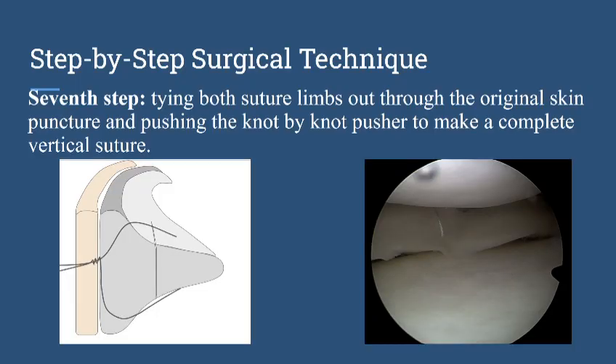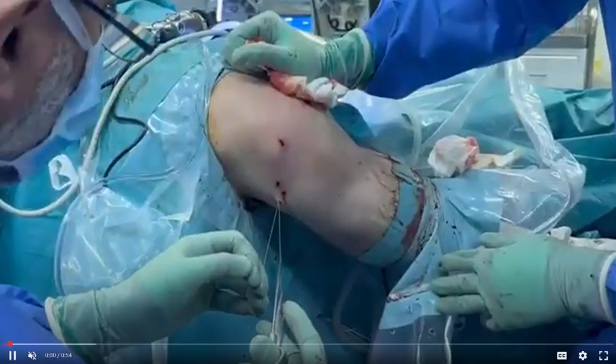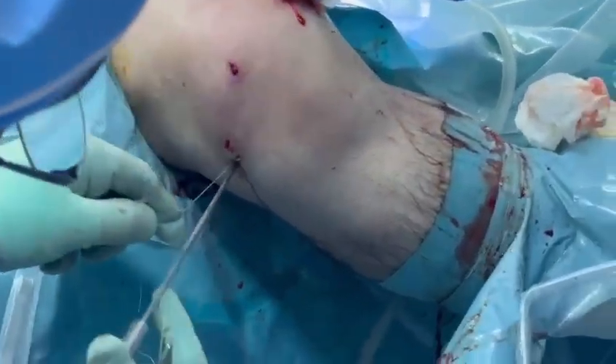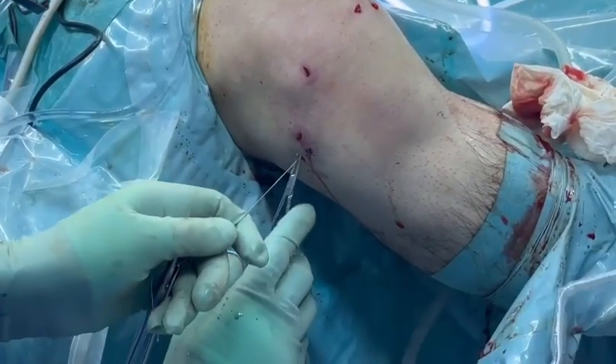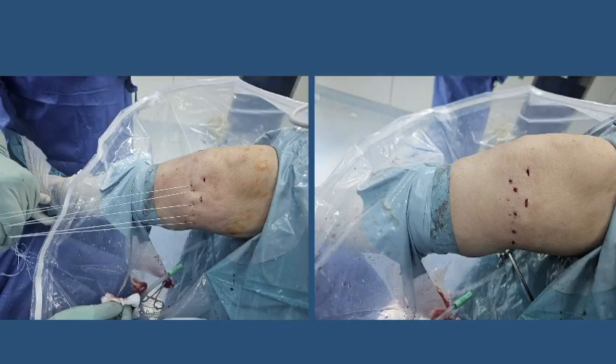After this we perform knot tying on a limited capsule bridge — which is why we call it the limited capsule bridge technique. We can make a mini widening of the puncture using a mosquito, and then do the knot tying. This is another case showing repair of the lateral meniscus, where we use the knot pusher and a surgical knot to secure the repair. We can then cut the extra suture using a mosquito and knife.